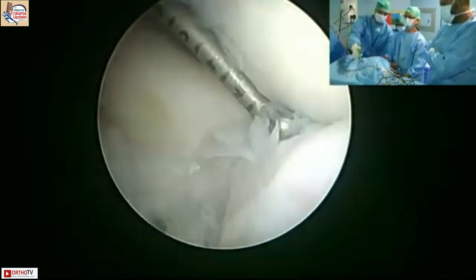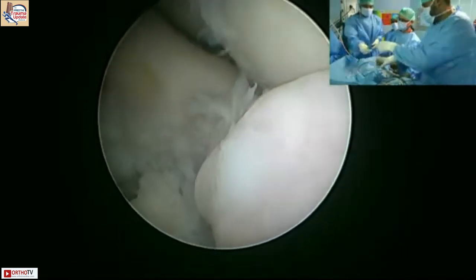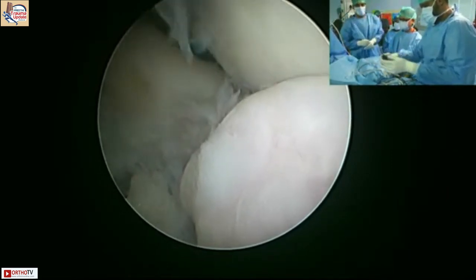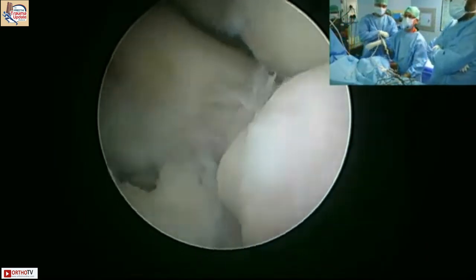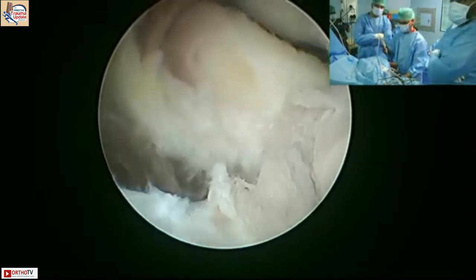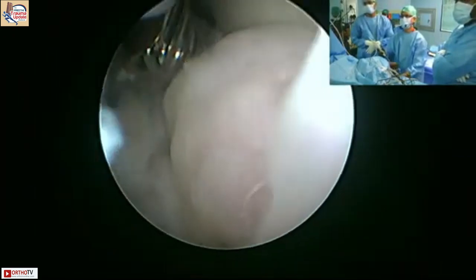Sir, for ECRB release, how much do you take and how do you know when to stop? So ECRB, if you go too much, you will go to ECRL because they have superficial fibers. So once you see muscle fibers and you've taken the tendon bit off, then you're good. Then you stop. Is it an ideal indication for a learner to start an arthroscopy? Maybe if you start with tennis elbow release, even if you are not successful the initial time, you can just put an incision on the outer side and get done with it. Absolutely. The only problem is your lateral.